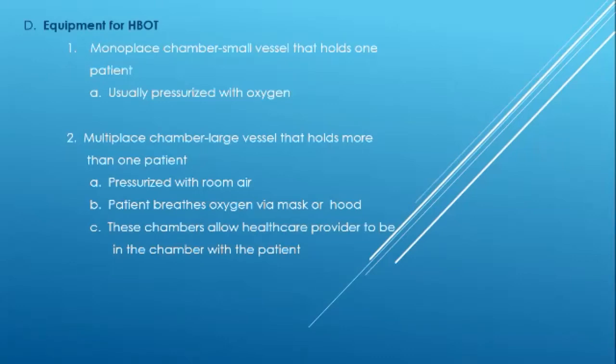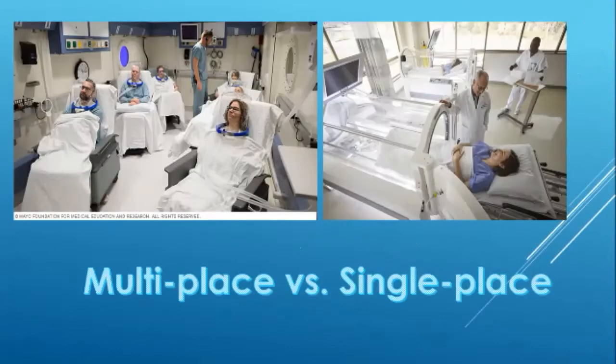These chambers allow the healthcare provider to be in the chamber with the patient without being affected by the high oxygen, okay? So now I can sit right beside you in the same hyperbaric chamber and I don't get the effects of the supersaturation because I'm not on oxygen. You are, right? And the room itself is pressurized with just regular room air, okay? Those are the only two types, monoplace and multiplace. Mono being one, multi being more than one.